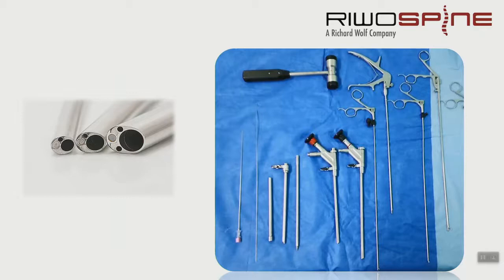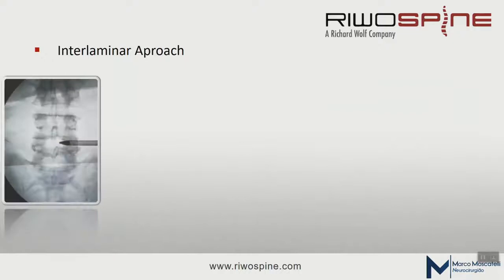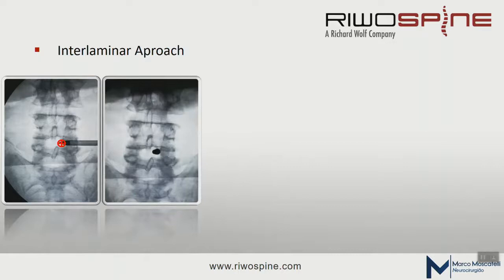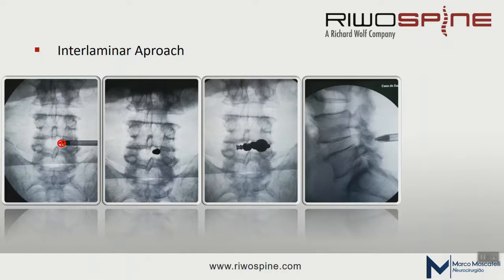We put the table in flexion to open the interlaminar window. I will talk about the step-by-step interlaminar approach. We start the procedure by marking and identifying the central part of the ipsilateral window, as medial as possible. We incise the skin and muscle fascia, with insertion of the dilator and later placement of the working sleeve, like this image. We check an AP view and lateral view to make sure the direction of the disc is at the correct level. We notice in the lateral view that the working sleeve is positioned behind the joint, keeping us safe, like this line.